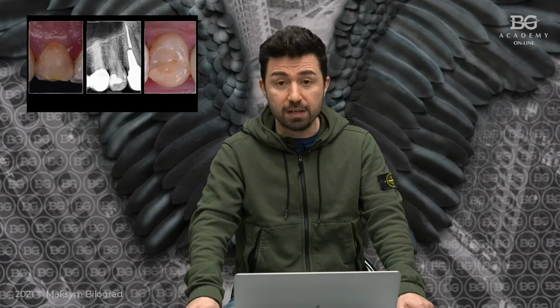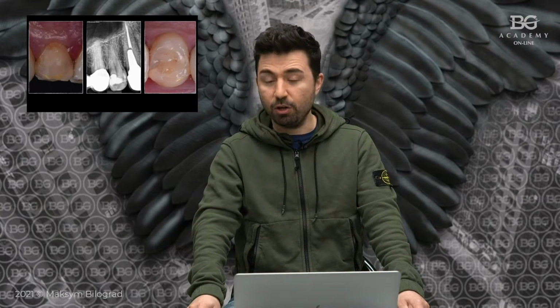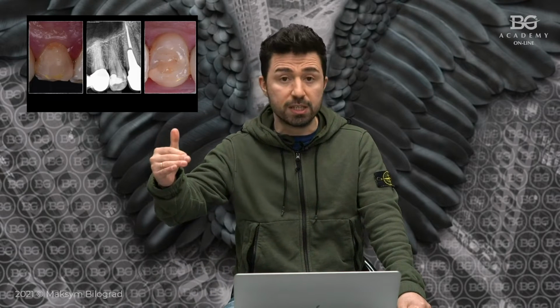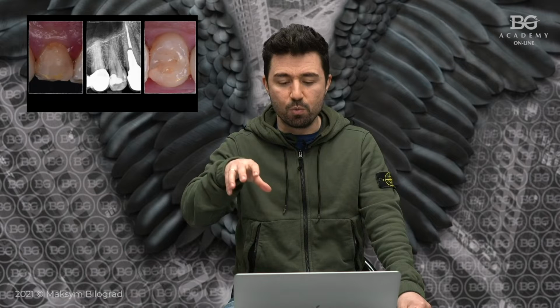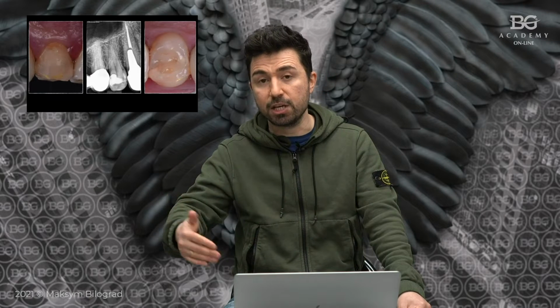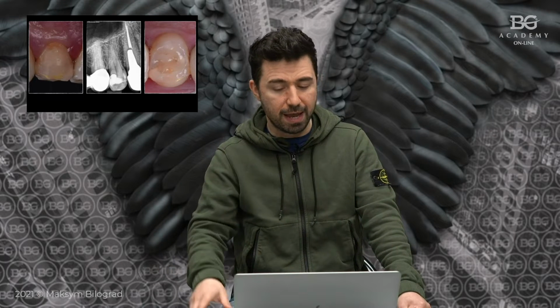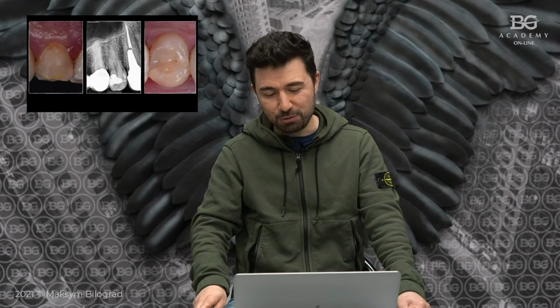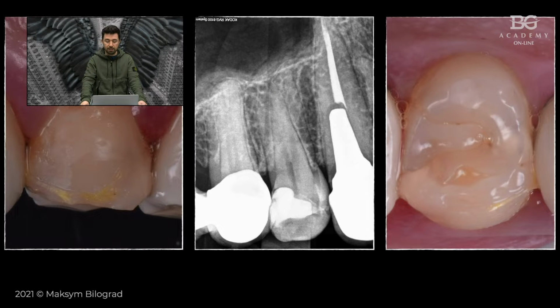Despite the fact that we got a case with irreversible pulpitis and symptoms, all the time you have to keep in your mind restorative part at the very beginning, because endodontic treatment itself is a very important step, but it is a step when you do complex rehabilitation for the tooth. After endodontic treatment, the tooth has to work, has to function. So restorative part actually gives you function, and that's why we have to think what kind of restoration to do and when actually to do this kind of restoration.